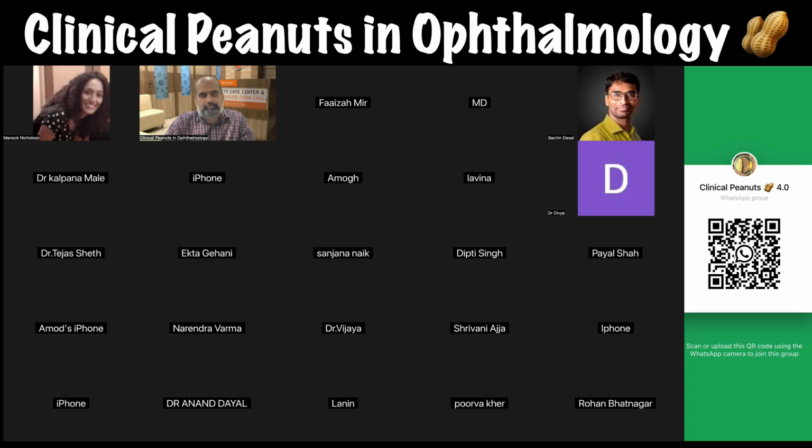So there are two totally different incisions, though one is dependent on the other, because you'll enter the amount of SIA you'll create with your incision and where your incision is located when you're planning your LRI. But LRIs honestly are great. People used to use them even in cases where there's no cataract, as a refractive surgery, as a method of correcting small cylinders. But again, these are not very reliable because they tend to regress over time. So you can't predict how much of an error they might produce.